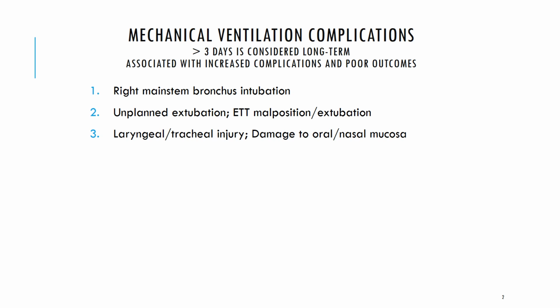However, we need to also think about patients who've been intubated for a longer period of time. So we kind of draw this line at 3 days, considering anything longer than 3 days to be long-term mechanical ventilation. Notice I'm not using the word chronic. We're talking about long-term mechanical ventilation. Now, 3 days might seem like a short amount of time, but think about it for a second. Being sedated with a tube bypassing your normal airway for 3 entire days, your risk for complications will start to increase.